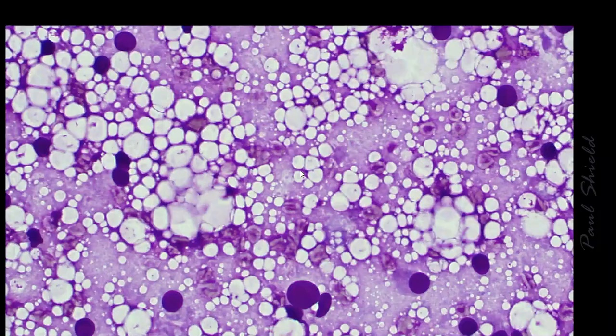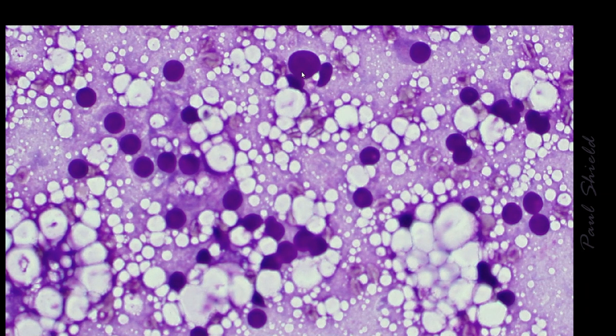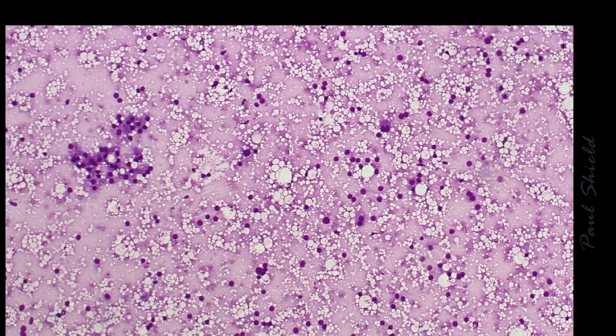And then classically in the background, we see both bare nuclei and ones with cytoplasm that are fairly large and round. And it's hard to see on a Giemsa, but on the PAP, we'll be able to see they have prominent nucleoli. And so these are quite fragile cells. That one there has got cytoplasm. They often lose their cytoplasm, and then that releases all this lipid. And so we end up with this very lipid-rich background.